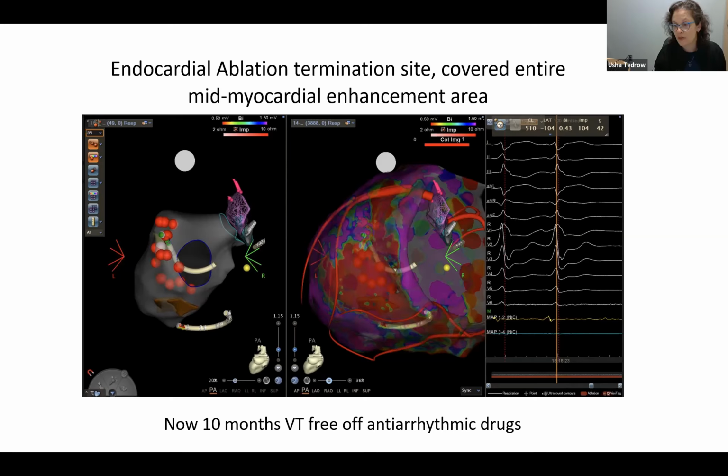They work together because ICE gives you the real-time information. Anecdotally, for a while I was doing my scans for the elective patients a long time before the ablation, and I feel like doing it really soon before is actually better, probably because fluid status and the ventricle are similar.